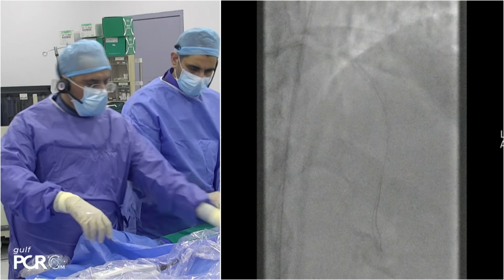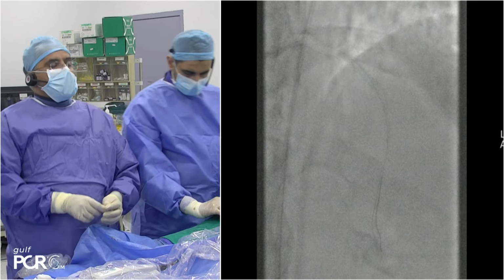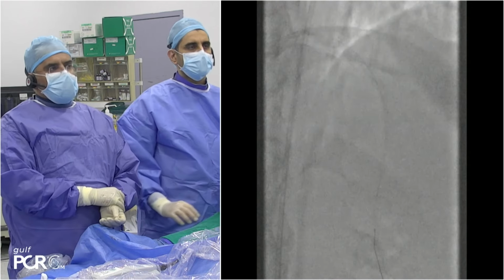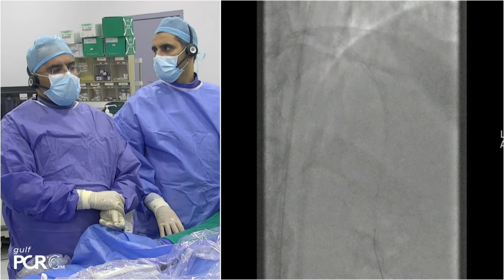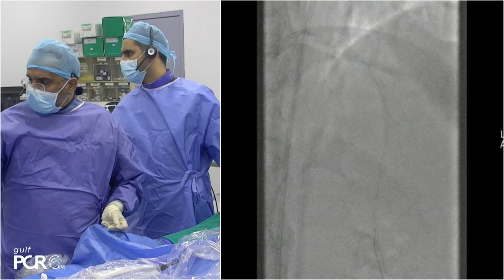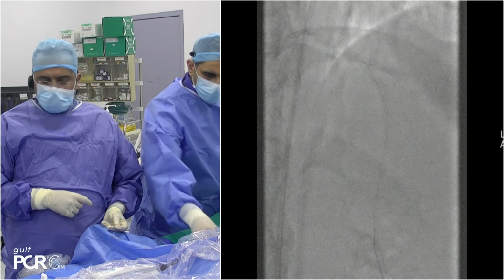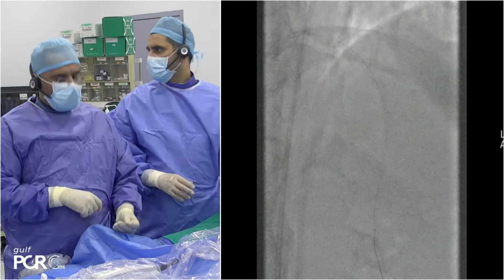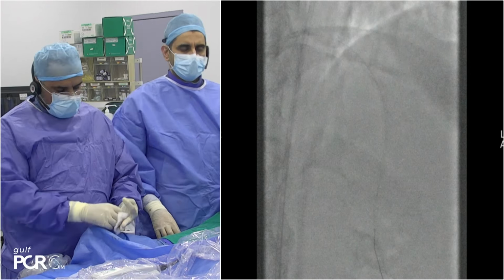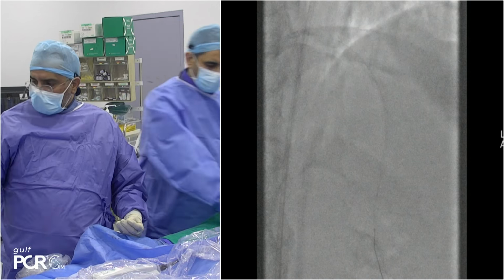Okay, let's have it. What size balloon did you take for the distal segment to optimize the stent under expansion? Yeah, so we went with a 3.0 balloon distally, and we are going 3.25 proximally. Okay, give us that. 3.25, yes. Okay, let's go.